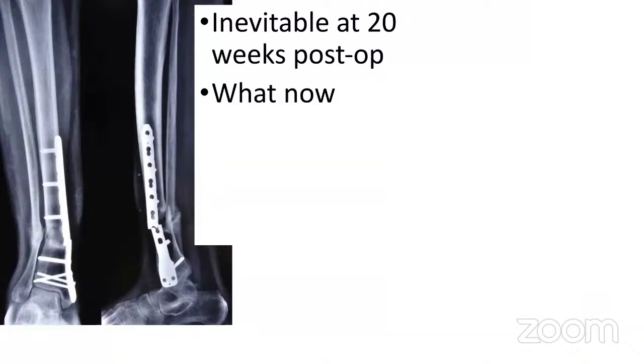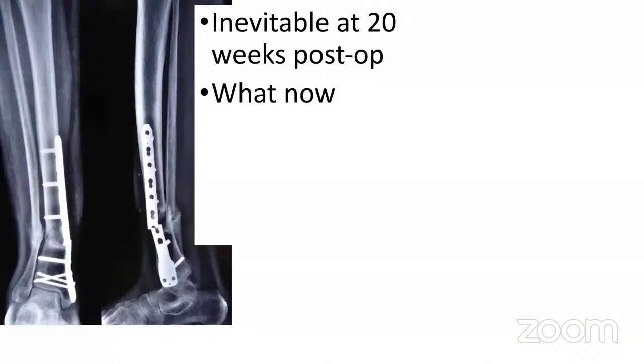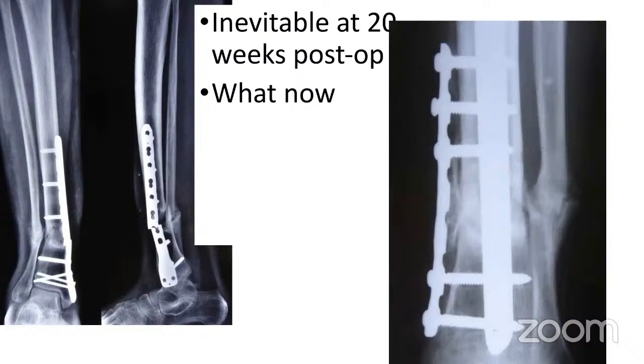Osteotomy of both fibula as well as the tibia. We have to do osteotomy, regain the length of the fibula, then correct the valgus of the tibia, and probably a wedge graft on the lateral part of the tibia, and plating of the fibula, nail and plate combination, or you can have another plate for the tibia. Okay, this is how it is done.